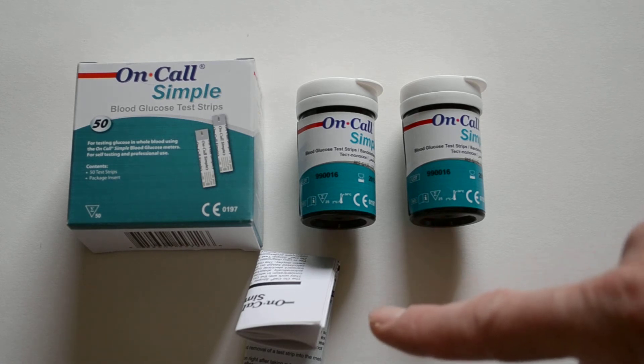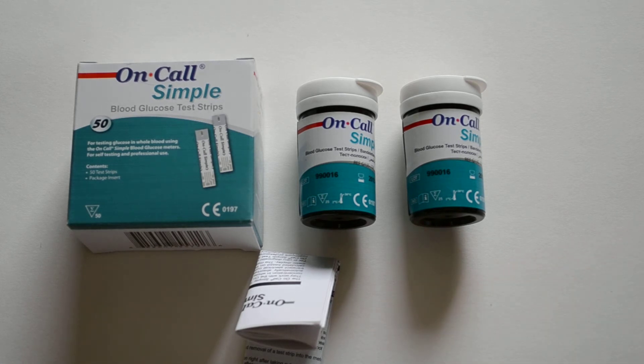You get a full data sheet included in the pack, shown here, which gives you all the specifications for the test. They are auto-calibrating, but there is the ability to buy a calibration solution for the meter if you think the results aren't running at what they should be. That's the On-Call Simple packs of 50 blood glucose test strips from Valumed.